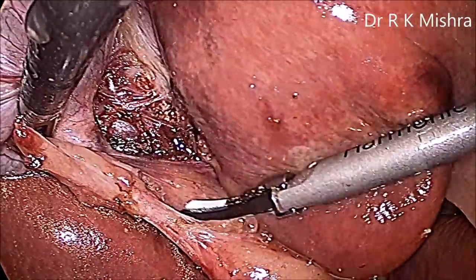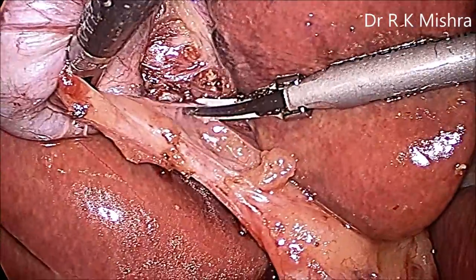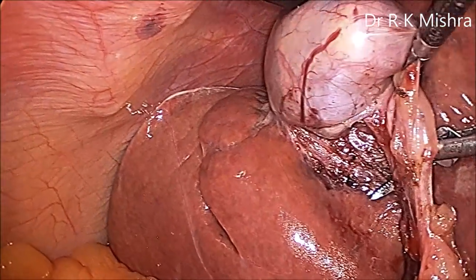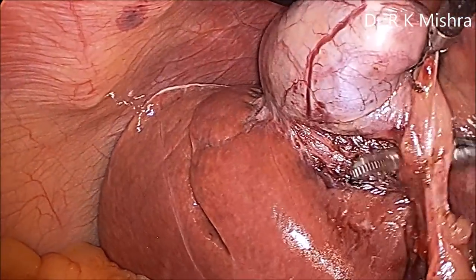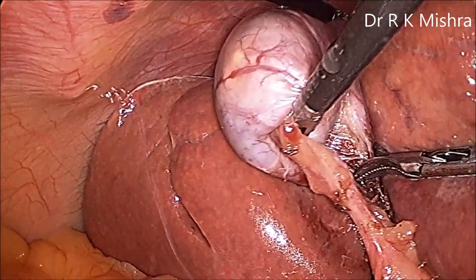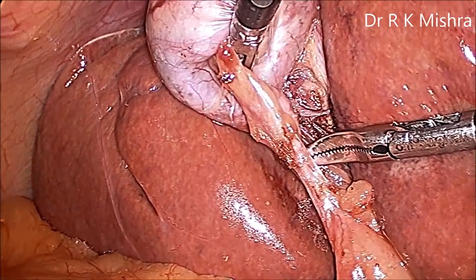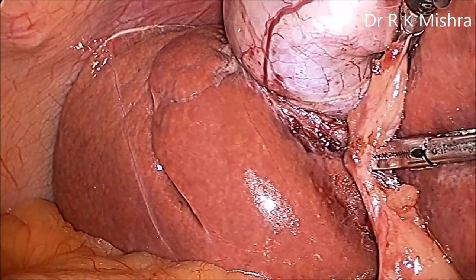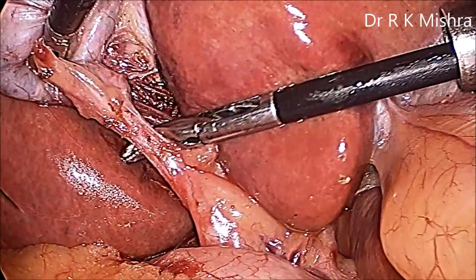Stripping should always be from above downward, not from below upward. For opening the anterior window, the Maryland dissector is the best instrument. Once the structure is skeletonized and peritoneum is separated, you can use the Maryland. The posterior window is clearly visible — 2.2 cm is free and the inferior surface of the liver is visible. Place the Maryland between the cystic duct and cystic artery to make the anterior window; the indentation should be visible, meaning the peritoneum is nicely stripped. Open the jaw slowly — a 2.2 cm window has been created.